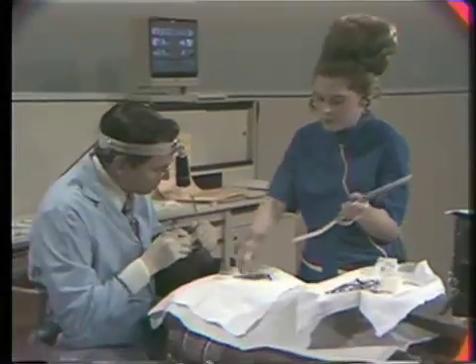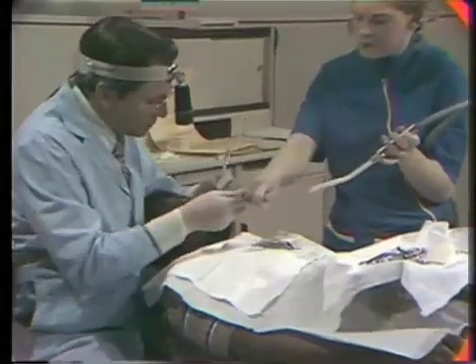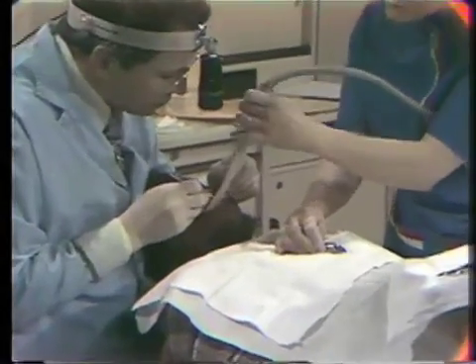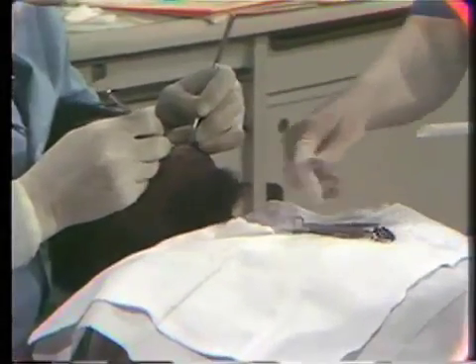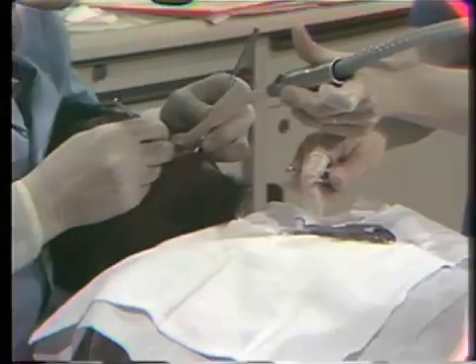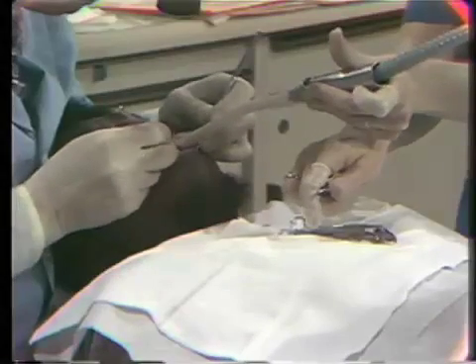Explore. Now notice how this exchange of instrument occurs. Lingual. Now, is there any sharpness in here at all? Good. Evacuate.